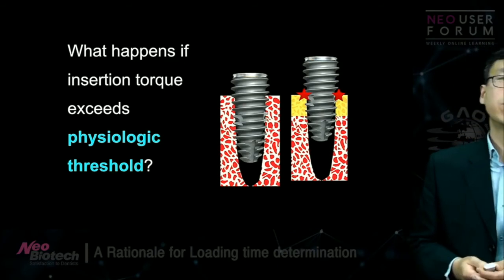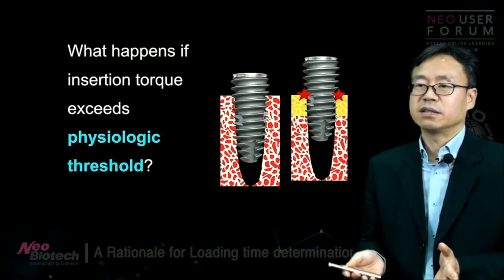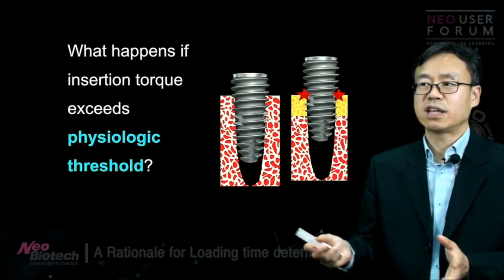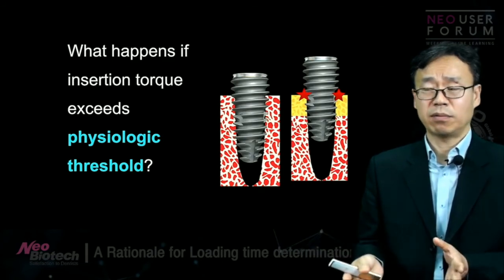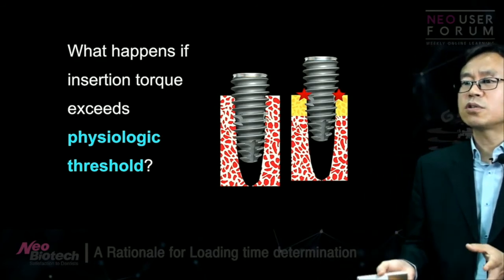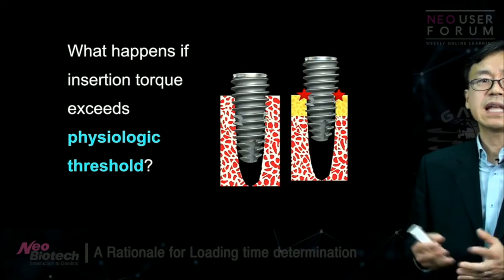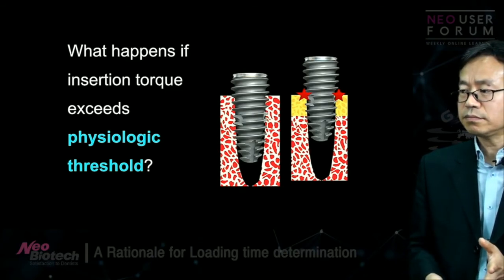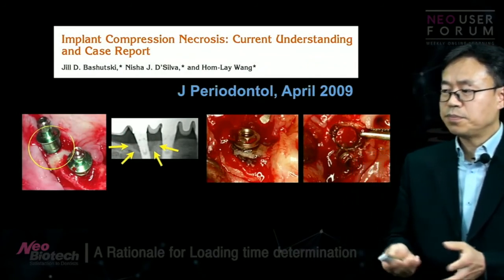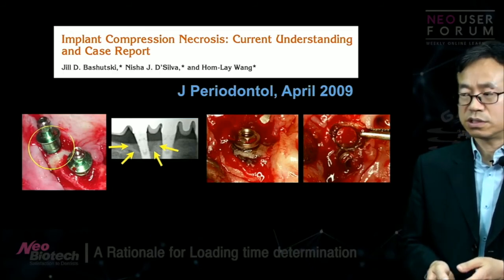Some people, usually beginners, tend to drill deeper or wider so that they can avoid these problems. So if the insertion torque exceeds our physiologic threshold, that can be a problem sometimes. Like in this case report by Dr. Homley Wang, he presented a case about 10 years ago, and it was about compression necrosis.